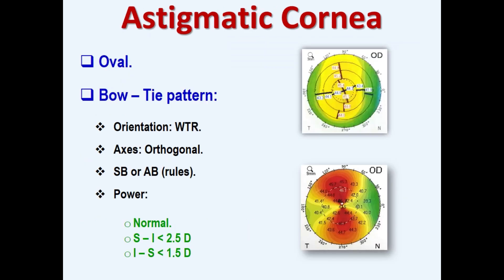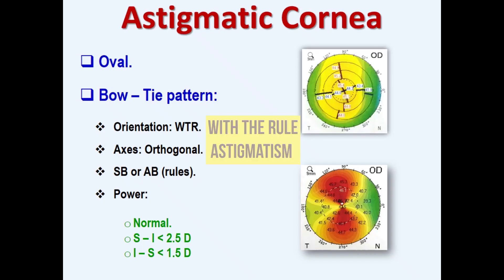Astigmatic cornea. A regular corneal astigmatism is orthogonal, that's to say its major axes are perpendicular to each other. Also, it can be fully corrected with a cylinder or sphero-cylinder lens. Most often, the corneal steep axis is vertical, that's to say with-the-rule astigmatism. Its magnitude or power is within normal limits.